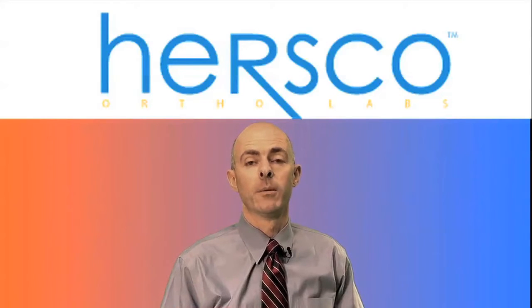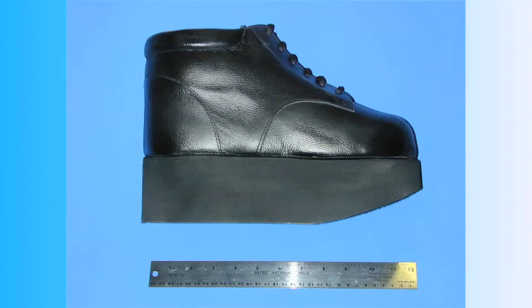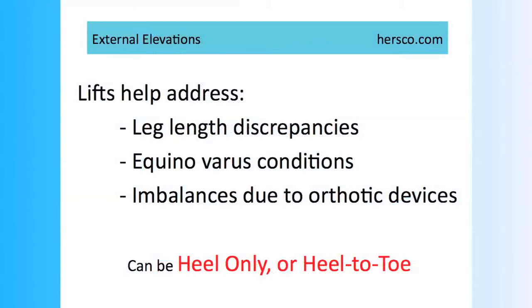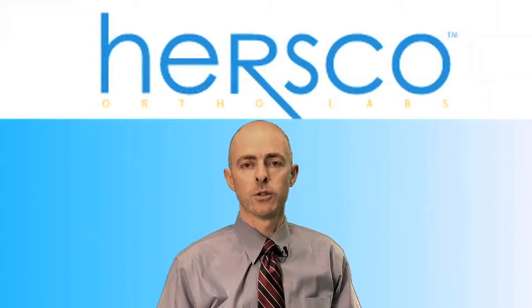One of the very common adjustments made to a shoe is the addition of an elevation or a heel lift in cases where the patient presents with a leg length discrepancy. Adding a heel lift to the external part of the shoe makes it very easy for the patient to choose a shoe that fits them internally, and then all the adjustment is made to the outside. Crepes or neoprenes can be layered up to make the shoe the correct height and bring the patient back into balance.